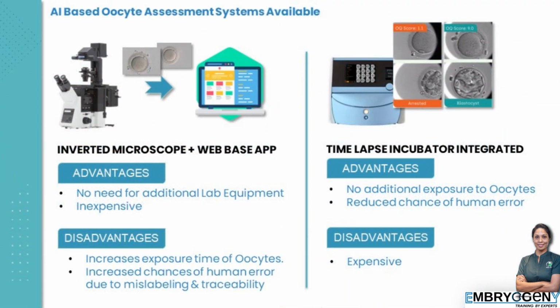At the moment, these are the two systems available for image capture. You can either use a high-quality digital camera attached to an inverted microscope to capture the images and upload it to an AI tool hosted on a web-based portal for analysis. The obvious advantage of the system is that it does not need any additional equipment within your IVF lab and is pretty inexpensive. The disadvantage being increased exposure time for oocytes for capturing the image and possibility of human error due to mislabeling and traceability.